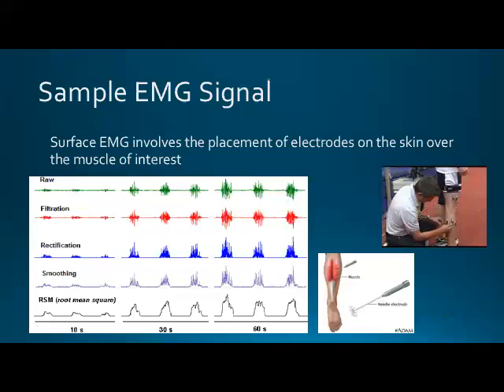You say, like, as you were specifying earlier, sound external noise would be associated with surface EMG and perhaps not as much with intramuscular? You can actually still get some noise, not as much, but you can still get some noise in intramuscular because it looks like it's wireless, but there's still a wire connecting the signal, and the skin is still partially open from where that needle pokes through. So you still can get some environmental noise.